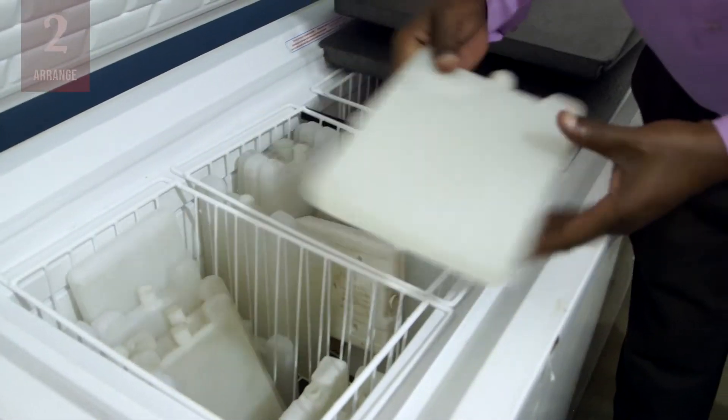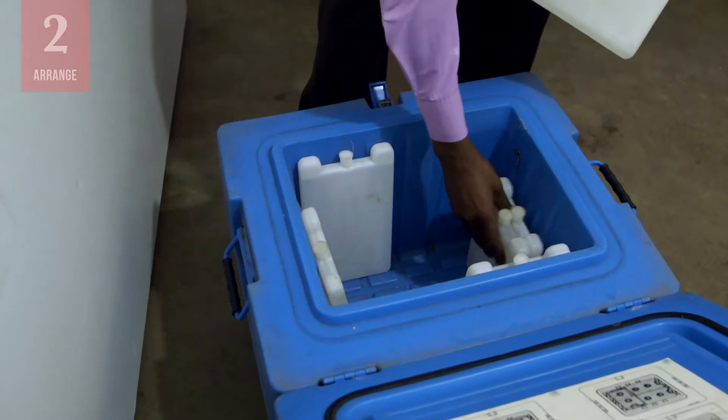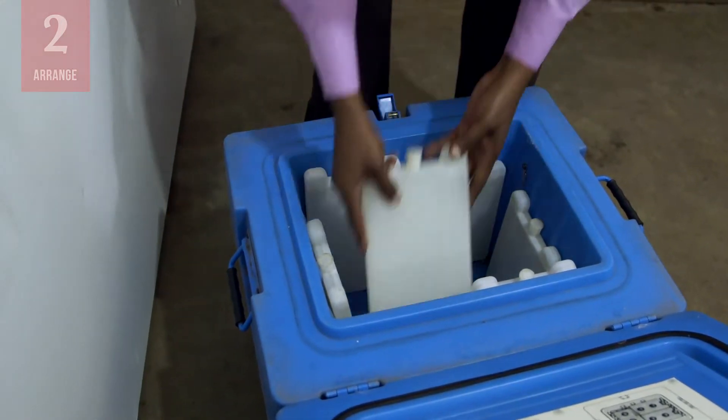Next, arrange the prepared water packs in the cold box exactly as shown in the manufacturer's instructions on the inside of the lid.